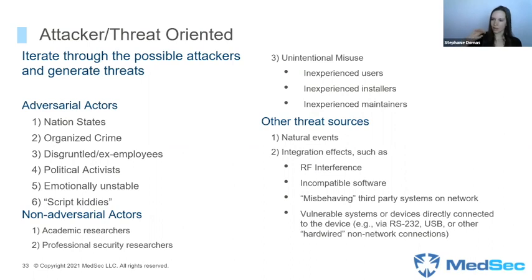And so it starts with less about your device itself and more just about the environment that it's going to be in. What risk does it represent? And so you're starting with who are the threat actors. This is a list. I can't actually remember which guidance document. One of the NIST guidance documents, I think, is where this list is from. The idea is basically you walk through who are various threat sources and ask yourself, what would a nation state want to do against my device? And you write those threats down.